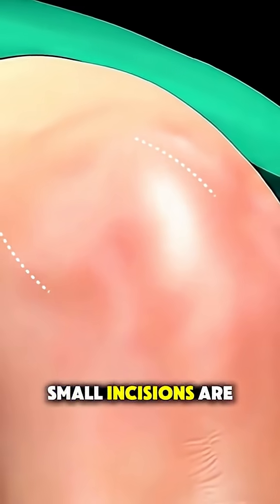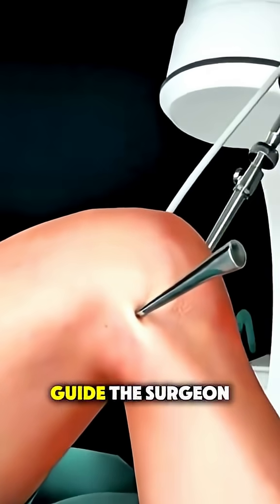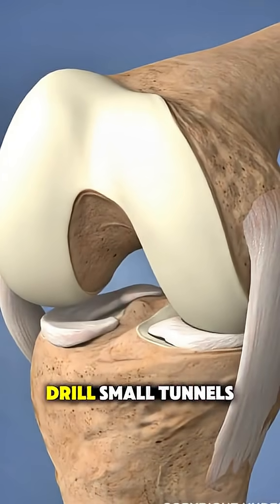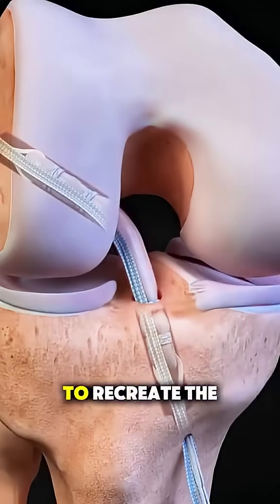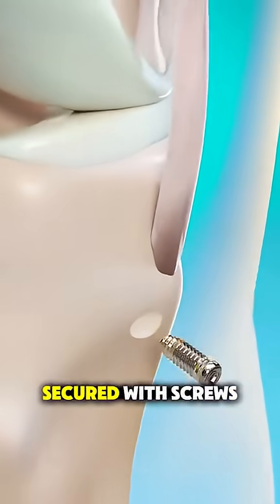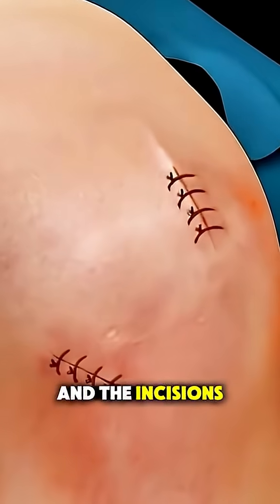Small incisions are made around the knee, and a tiny camera called an arthroscope is inserted to guide the surgeon. They remove the damaged ACL, drill small tunnels into the thigh bone and shin bone, and thread the new graft through those tunnels to recreate the original ligament's position. The graft is secured with screws or other fixation devices, and the incisions are closed.